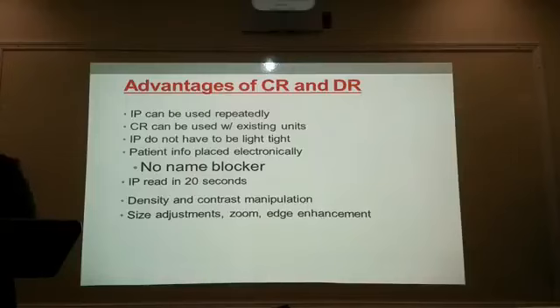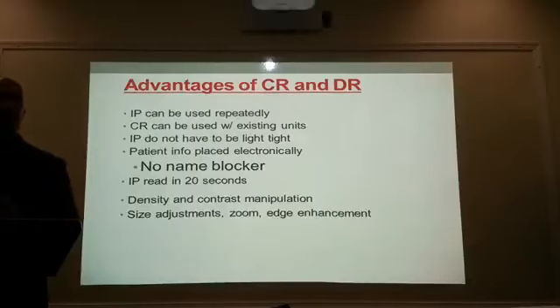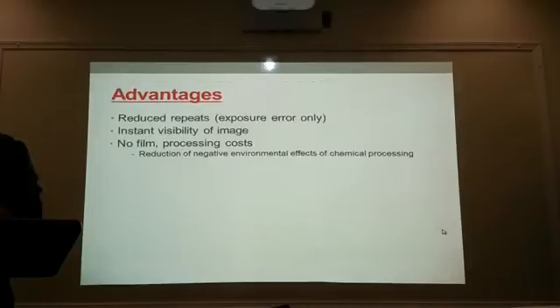Okay, we'll skip this. Can be read in 20 seconds. Everything can be manipulated: contrast, brightness, your zoom, your enhancement. Okay, negative and positive images, cropping, all that stuff can be manipulated.